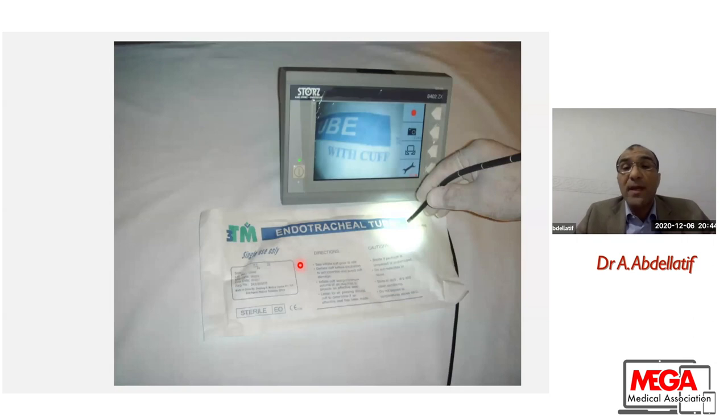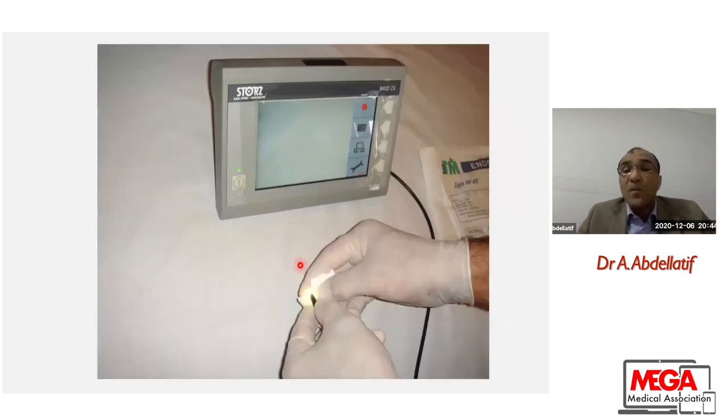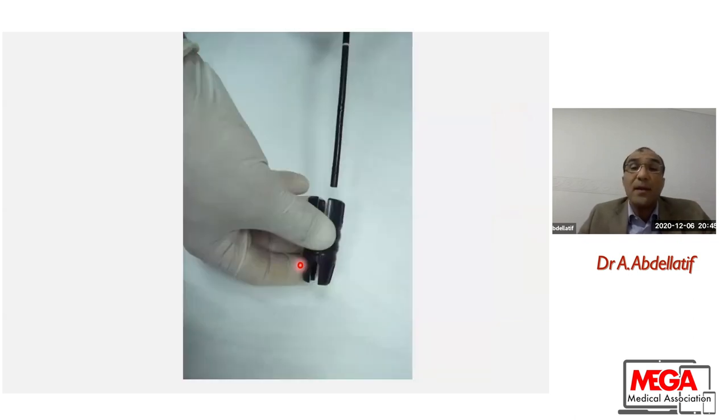Then I have to make sure that I can see a very good image before I go inside the patient. I will put the distal end of the scope on any letters and check the accuracy of the letters. Sometimes a small dirt or remnants of the sterilizing solution may remain on the camera. Maybe I can get some alcohol swab and clean it and make sure that I can see well.